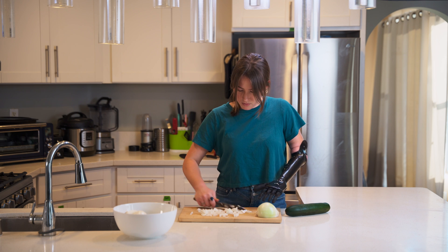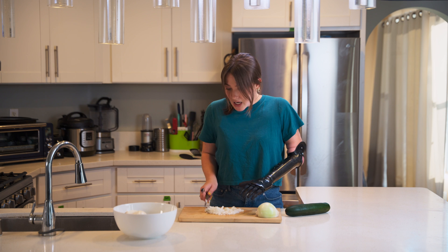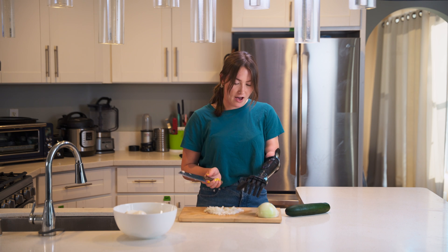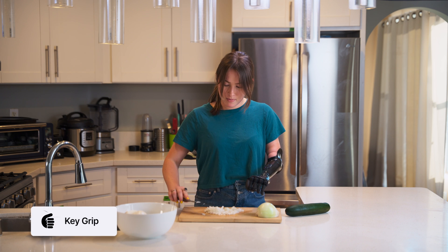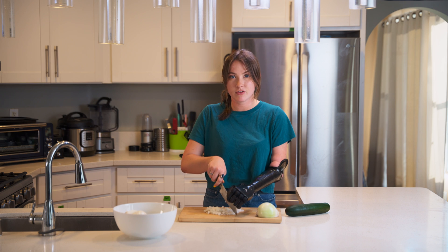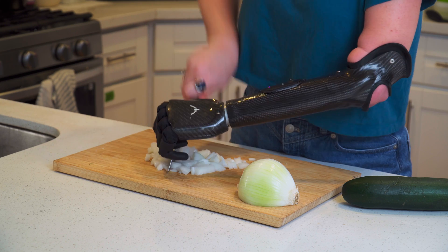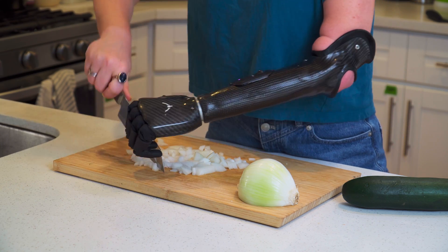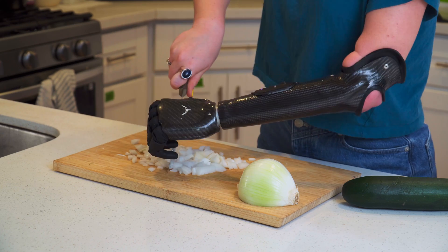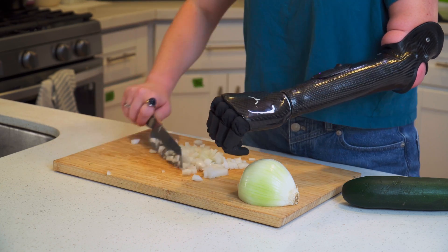Okay so now we have all of those bits, and then I can show you how I could cut it even finer. Typically to do this I would have my hand in key grip, and I would use key grip to press down on the front of the knife and really put a lot of pressure on it so that I could get a really strong cut if I wanted to cut these bits up even finer. So while I'm doing this I'm really pressing with my bionic hand on the knife and then I can make the chops with this hand.